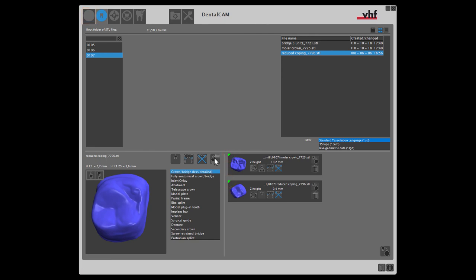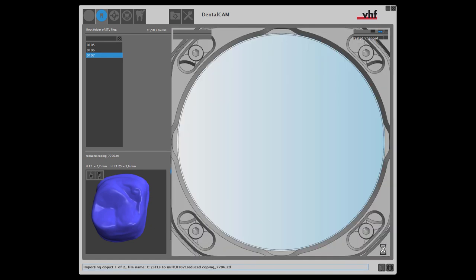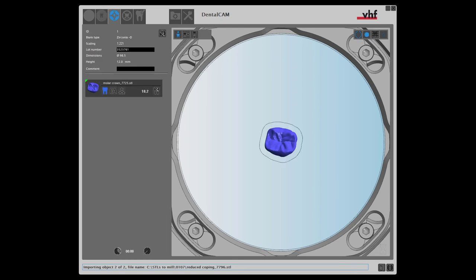Time to add the objects to the job. Dental cam will now automatically open the nesting view. This is the next step in our workflow.